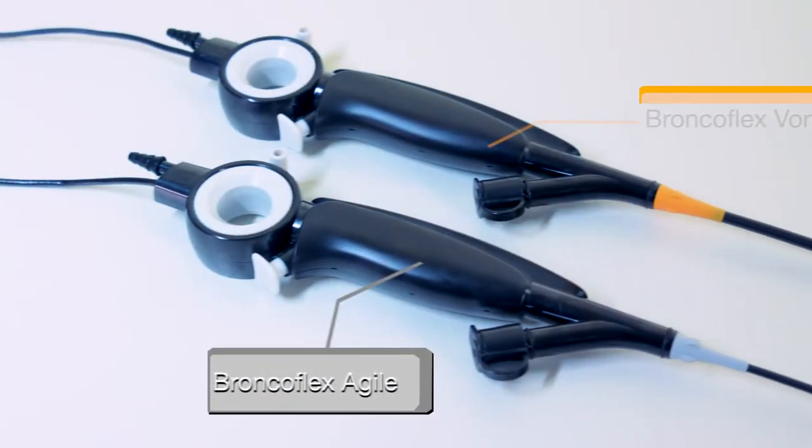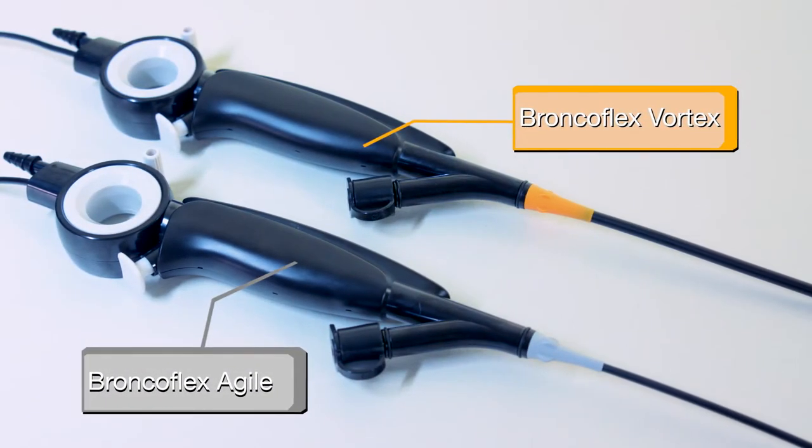The BroncoFlex is available in two sizes that are color-coded: gray for BroncoFlex Agile and orange for BroncoFlex Vortex.